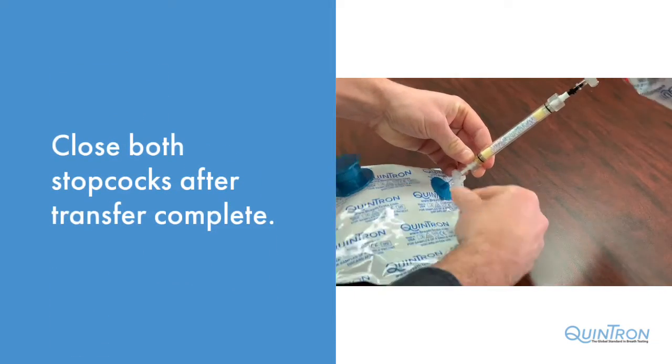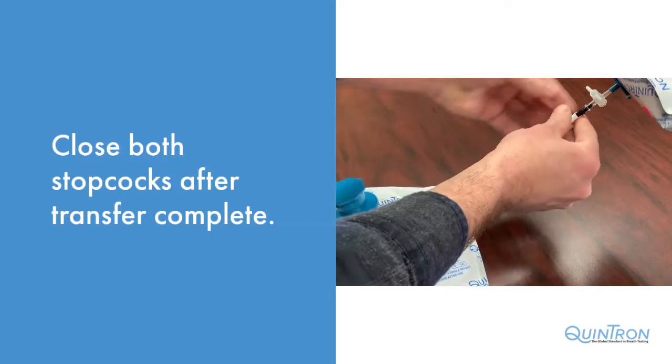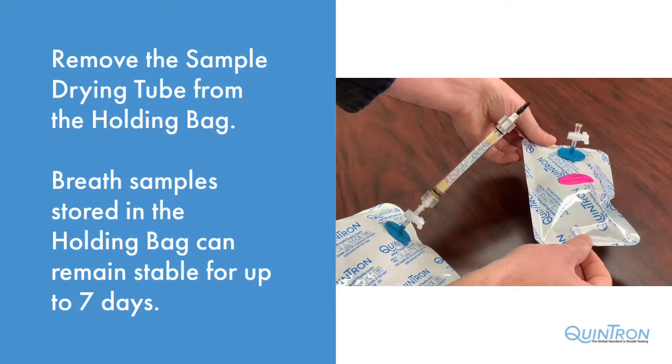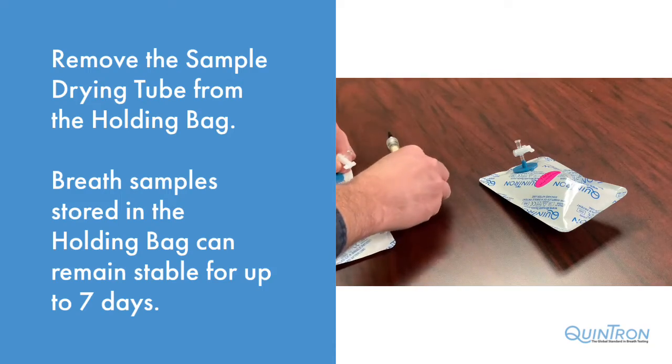When you have sufficient sample in the sample holding bag, close both stopcocks. Remove the drying tube from the sample holding bag. Samples stored in this bag are stable for up to seven days.